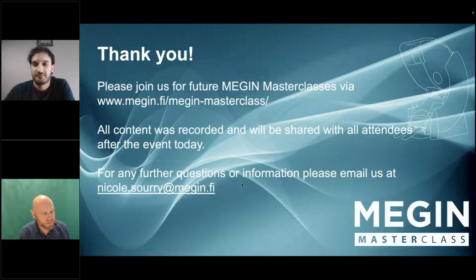Okay, so next question is, shouldn't we be filtering before downsampling? That I also looked into, and the downsampling algorithm in MNE Python is doing filtering to avoid aliasing. So again, I'm going to put in a link for that as well. There's also a discussion on the MNE Python site. So yes, it is being done.